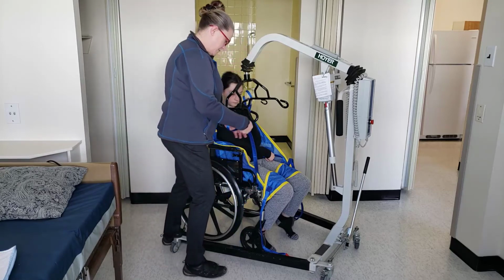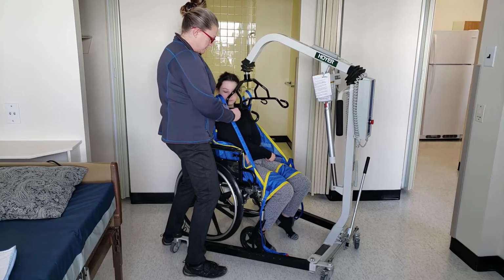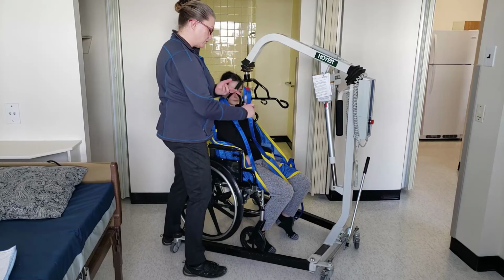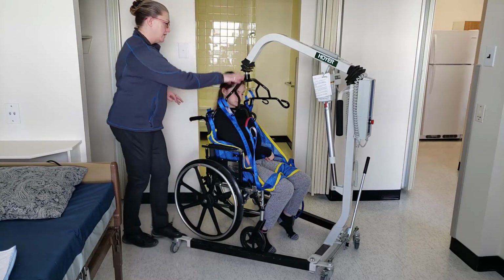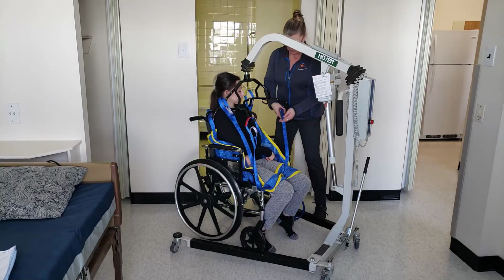The middle strap, either the shortest or the middle. Again, it'll be tenant preference. And you want to be careful that you're not going to pinch your fingers when you're hooking them up. So making sure that the swivel bar and the boom is low enough. So you're going to go from side to hook them up.